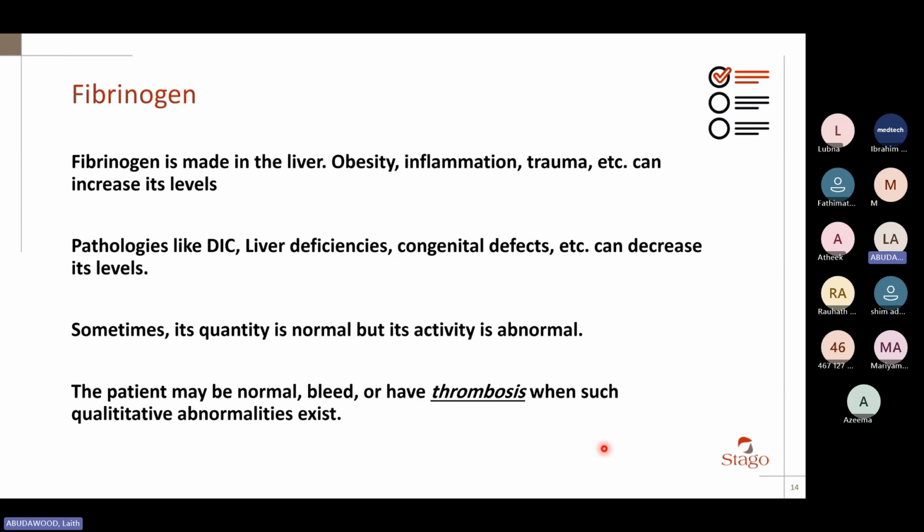When I run a fibrinogen assay, if the result is normal, within the reference range, then generally I can say that fibrinogen is okay in terms of quantity and in terms of quality. Because if the quantity is okay, the clotting time will be normal. If the quality is okay, no mutations, no problems with the structure of fibrinogen, the clotting time will be okay. So the quantity I understand. The less the quantity of fibrinogen, the longer the clotting time. This is clear. How about the quality?